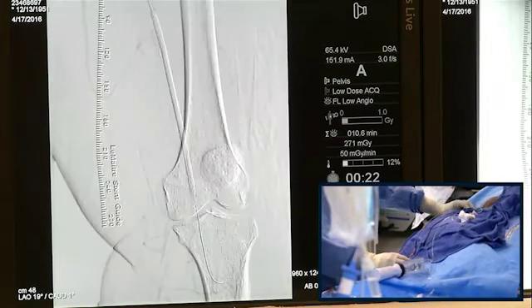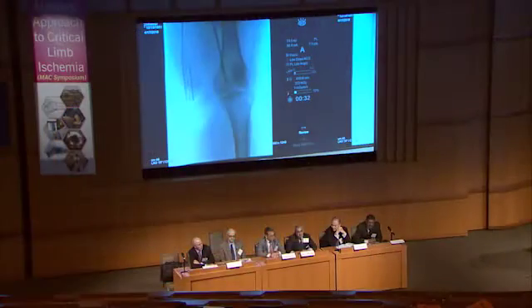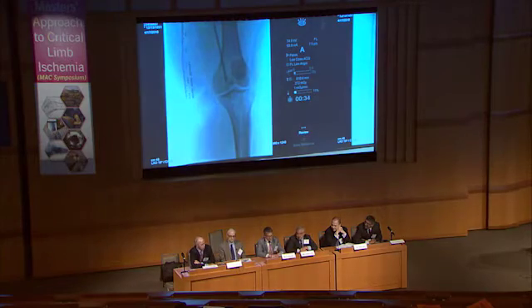So John, looking at this picture, looks like the communications are probably slightly more proximal, is that right? Because you released the balloon more proximally, there's more filling of the vein. What do you think? Yeah, I'm still a little bit confused, quite honestly, in terms of where all the communications are. I think there's multiple, and that they're not really distinct or discrete. So it'd be nice to see what things look like once all of the stenotic lesions are open as well, and there's less resistance to flow in the SFA, as to whether some of those communications will become less obvious.